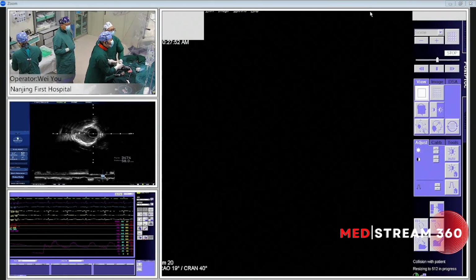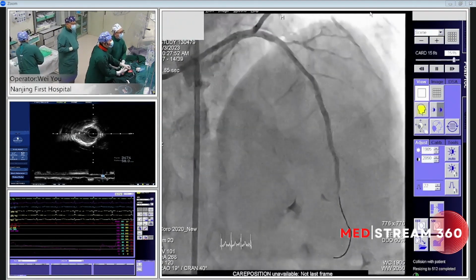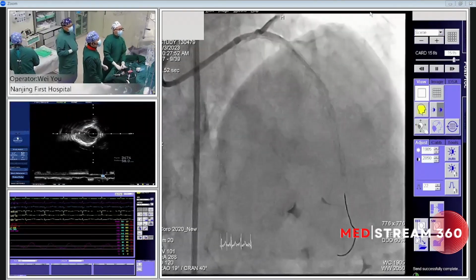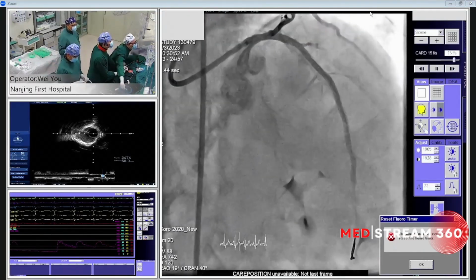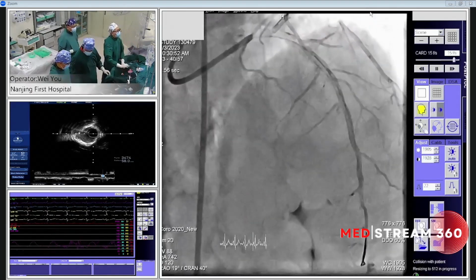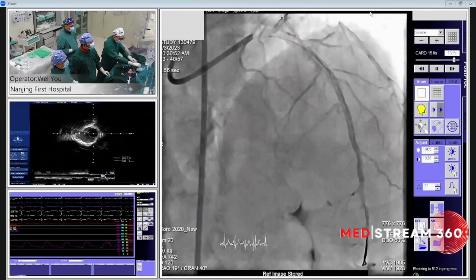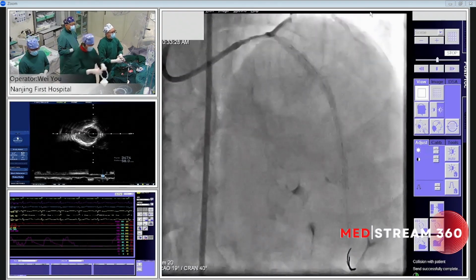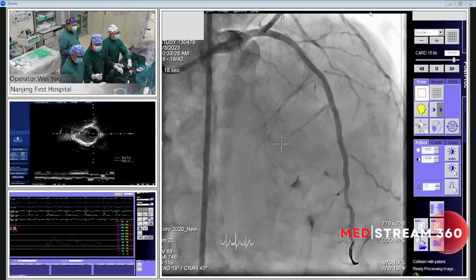Okay, take a picture, please. It's good. So Chief, do we need to protect the diagonal? Seems okay. Distal segment flow is good. The first diagonal flow is only maybe TIMI 1. We should give some nitro. After the 2.5 post-dilation, I will give a picture. Oh, nice, very good. Nice. 3.0.